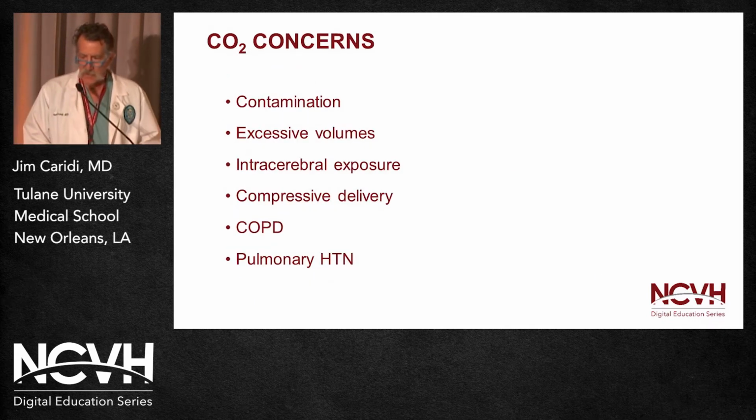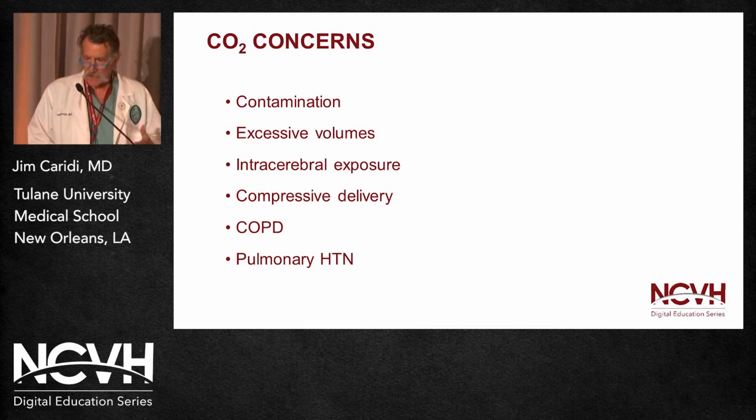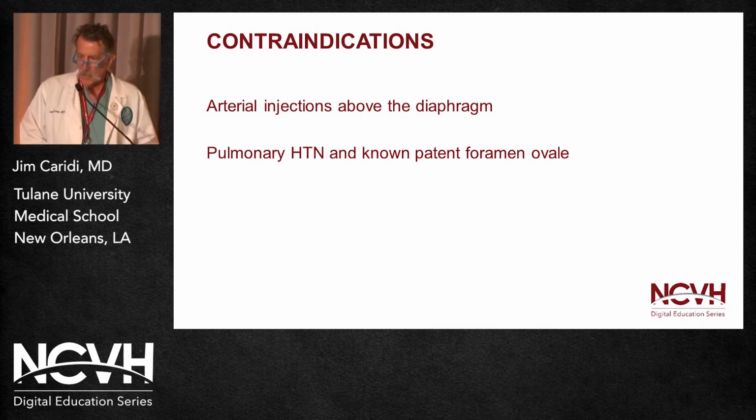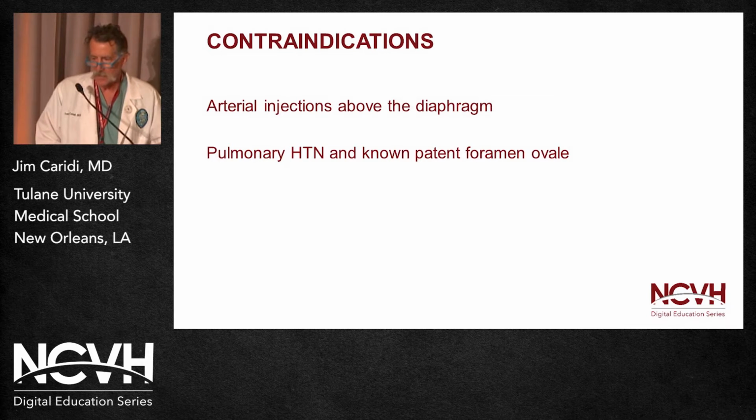There have been CO2 concerns, which I'm not going to get into today: contamination, excessive volumes, intracerebral exposure, compressive delivery, COPD, and pulmonary hypertension. But with a little bit of knowledge, you can eliminate those. The only contraindications we have with CO2 are arterial injections above the diaphragm and pulmonary hypertension with a known patent foramen ovale. And I say this is theoretical and has never really been described in the literature.